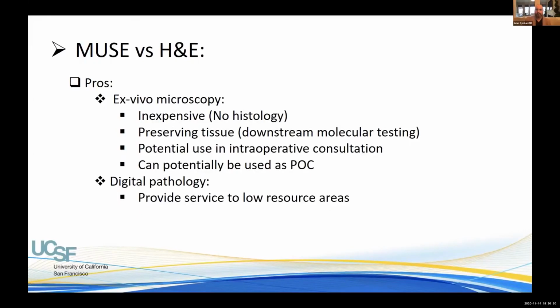And it's an ex vivo technology, meaning it's first inexpensive because we don't need histology. There is no need for hiring people, cutting the tissue, lots of devices, very expensive devices, because you just need one biopsy. And the microscope, if it goes to mass production, could be even close to $1,000 or $2,000, which, compared to a regular microscope, is much cheaper.